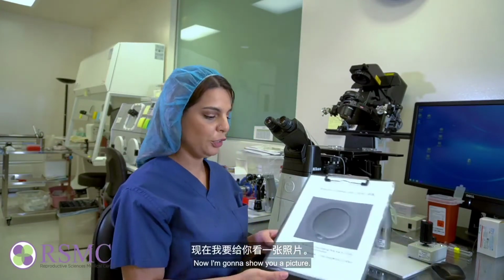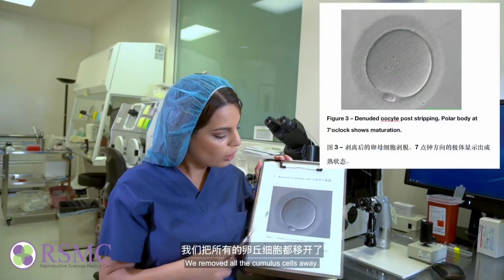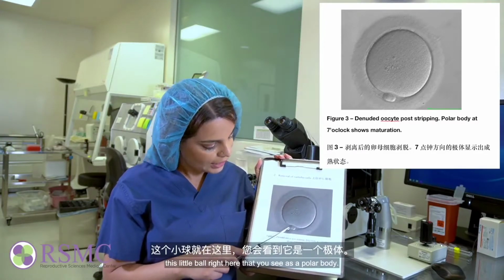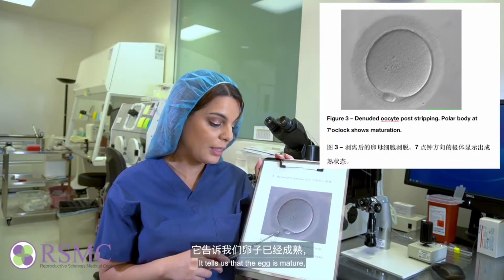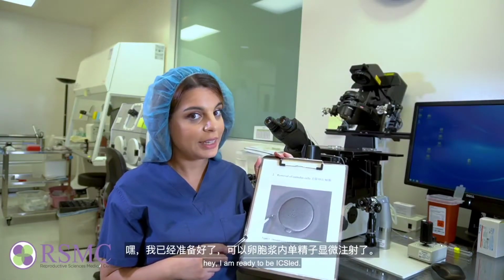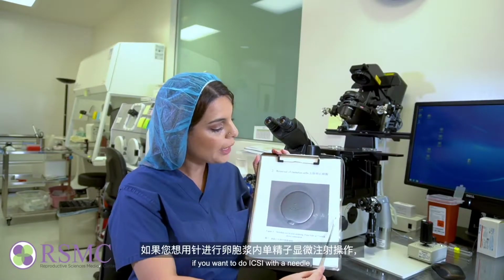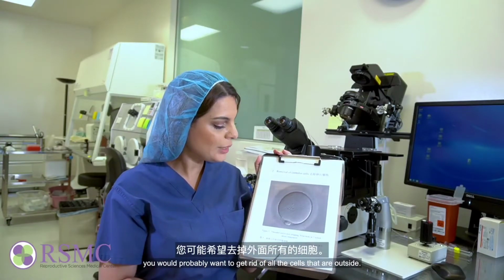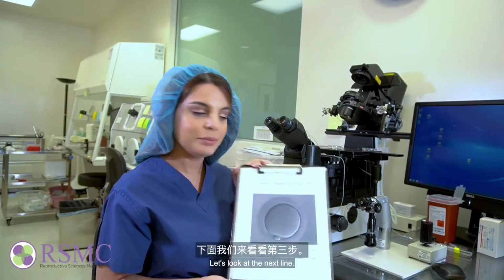Now I'm going to show you a picture. This is our nicely stripped egg. We removed all the cumulus away. And right here, this little ball that you see is our polar body. What does this tell us? It tells us that the egg is mature, which means that, hey, I am ready to be ICSI'd. The other thing is, like I was mentioning, if you want to do ICSI with a needle, you would probably want to get rid of all the cells that are outside. And I guess this is step number 2 for you. Let's look at the next slide.